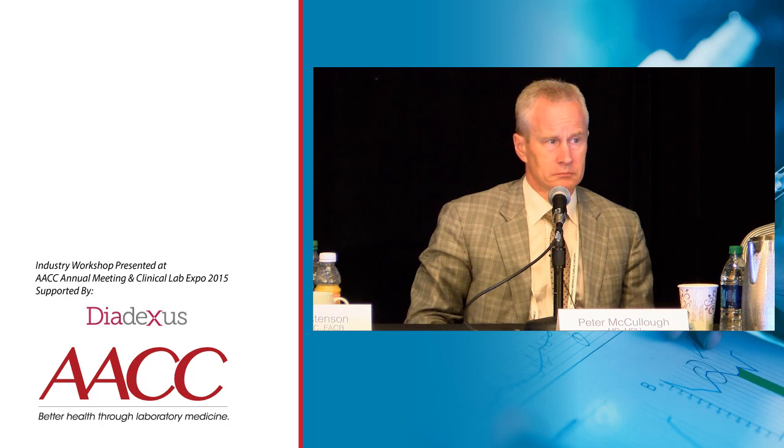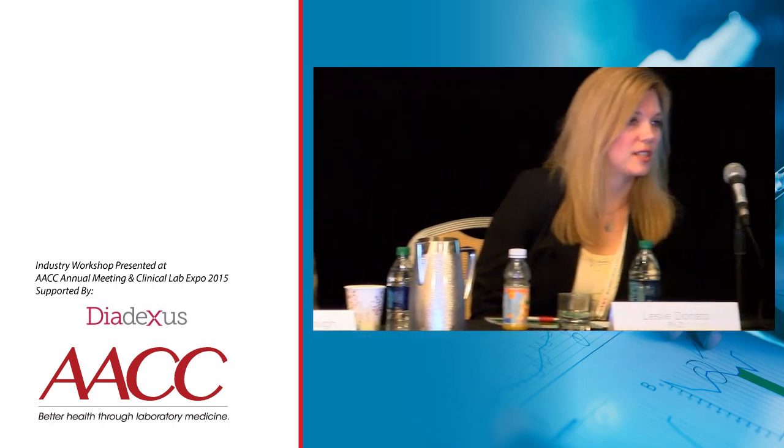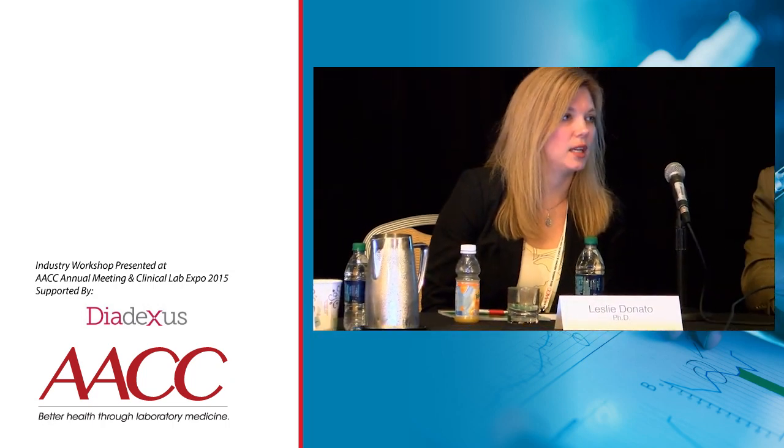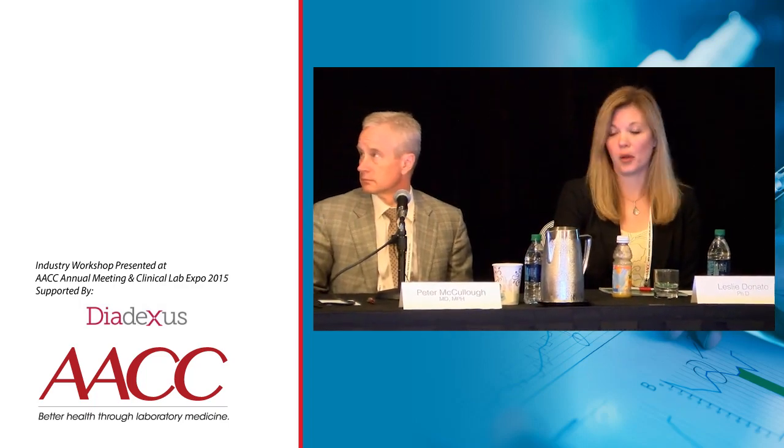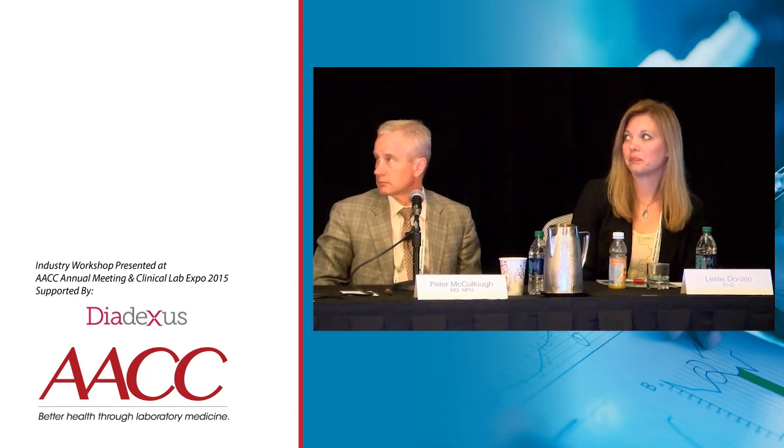No, not that we know of. The patient does not need to be fasting, and to my knowledge there is no known medical interference. So really the pre-analytical phase seems to be very straightforward with this test.